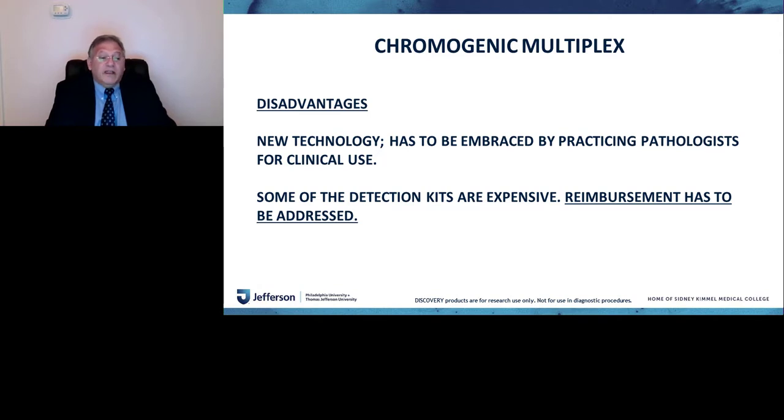The good thing is that the new generation of pathologists, the young pathologists, are extremely happy with all these possibilities that are coming down the road. The other issue, if we are going to use multiplex in clinical practice, is that we have to think about the cost. Some of the kits are expensive, and reimbursement is an issue. Basically, this is something that we have to face.